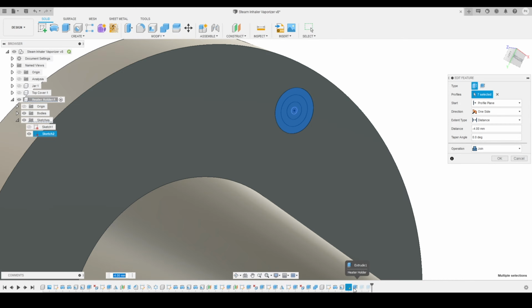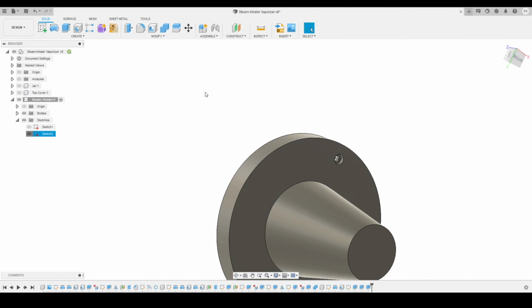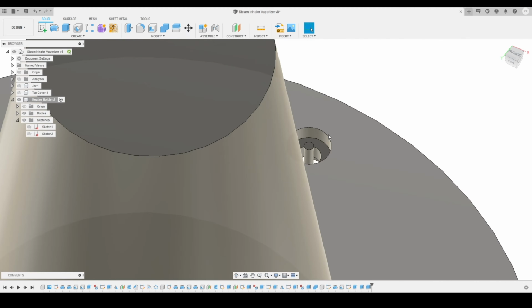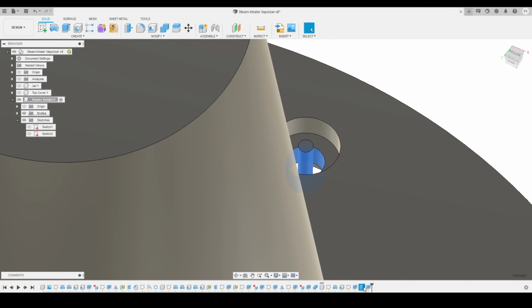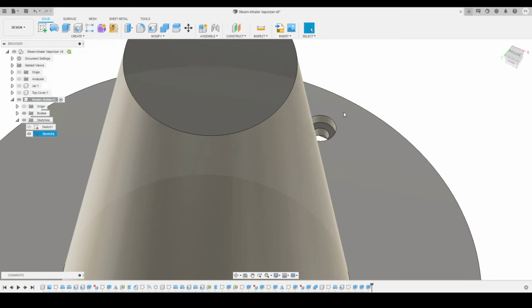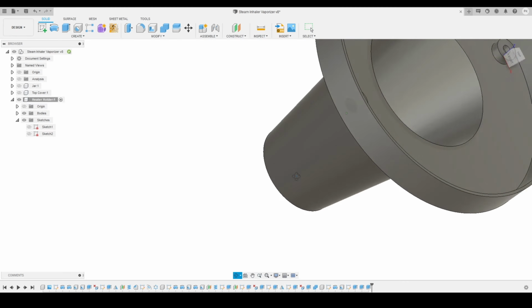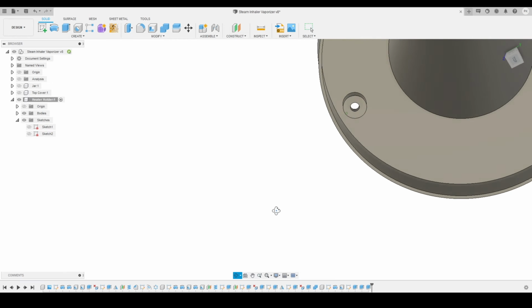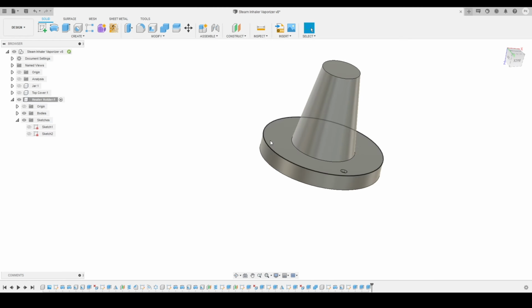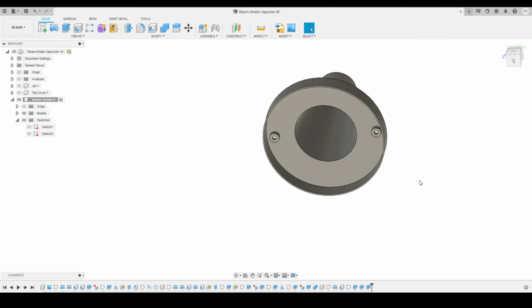If I turn off the sketch, you can see how it is looking right now. So I had created this. So you can see there is a small problem here. So what I will do, I will just make sure that I had extruded all the profiles. Here it is. So here you can see this is what we had created on the face of this heater holder, and this is for the screws where the heater plates are going to be fixed. So that's why I had created this.